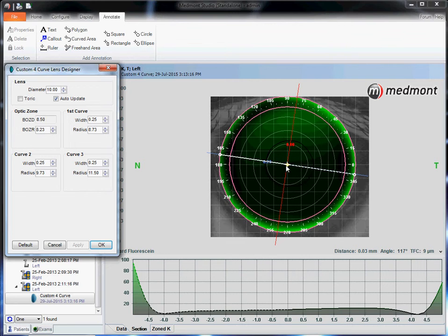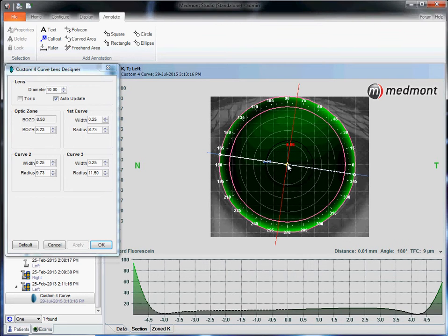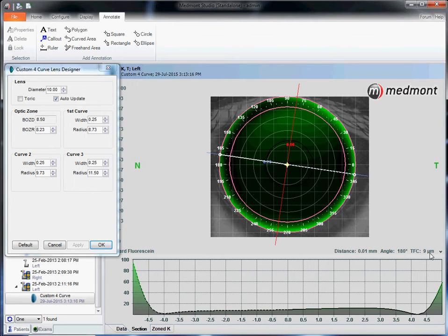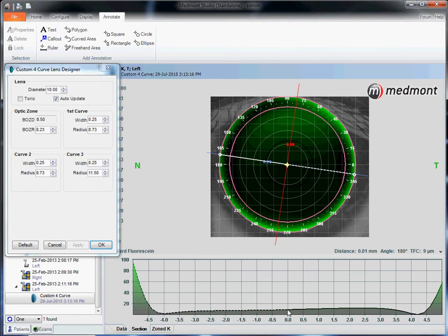Now we click our cursor in the center and determine the amount of fluid. The TFC or tear film clearance is 9 microns. There's 9 microns of fluid between lens and cornea and that's visible on the graph. Zero along the x-axis is the corneal surface and we see in the center we have some fluid between the apex of the eye and the back of the lens. This is displaying the fluid layer between lens and cornea.